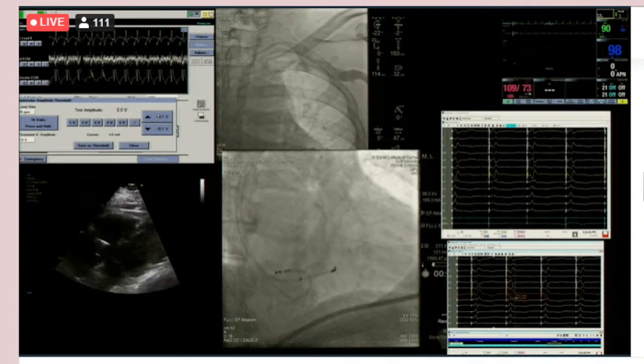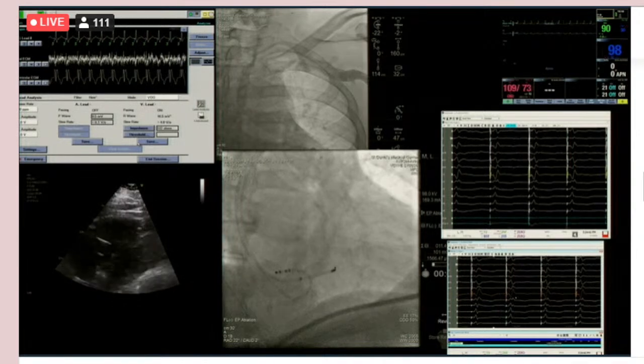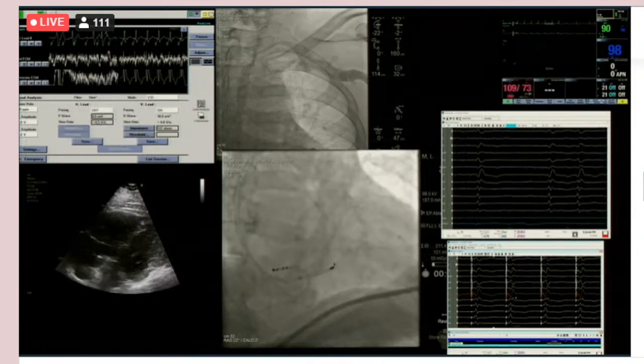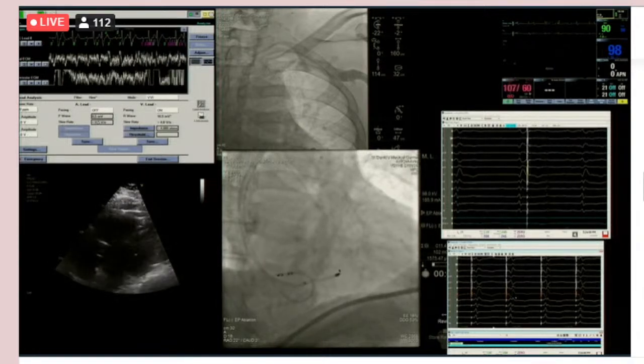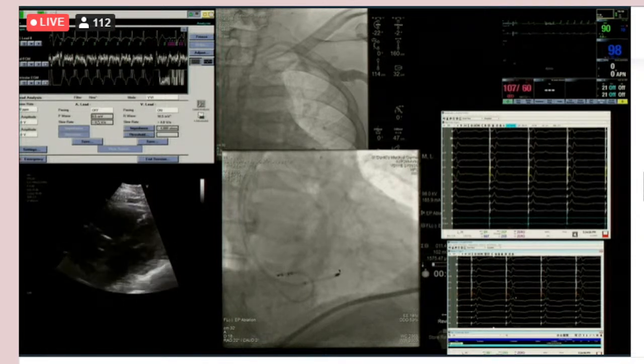So what I might do is take a little bit of a risk and torque it in just a tad more. Obviously, if you go too far, you got to start over. Back to 5. And now, Rodney, are you using the C315 sheath? Yes, this is the deflectable sheath that's intended for this. Okay.